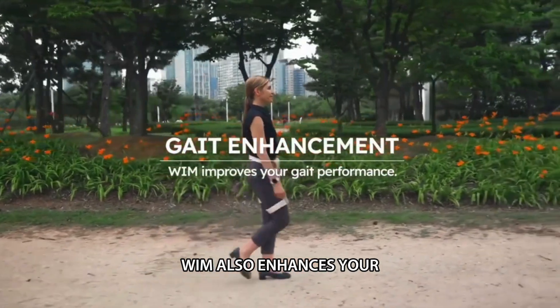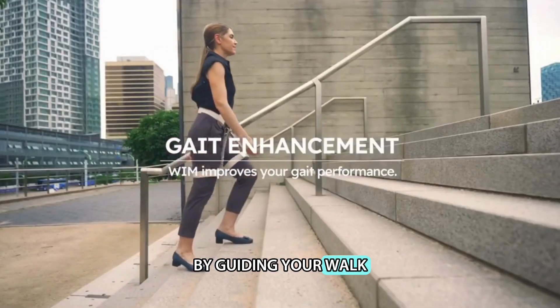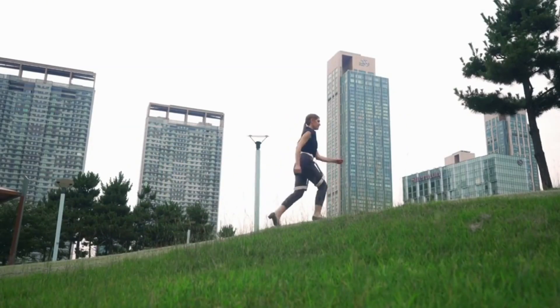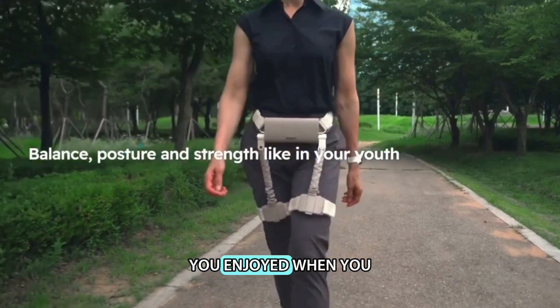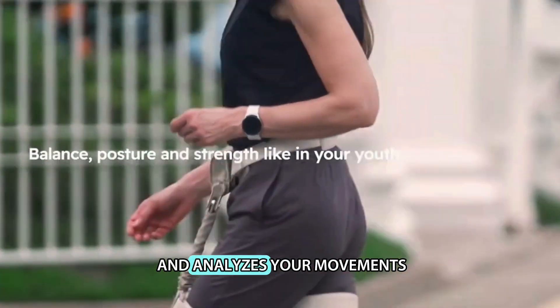WIM also enhances your social and physical activities by guiding your walk. Imagine extending your walking distance and reconnecting with activities you enjoyed when you were younger, all while WIM supports and analyzes your movements.